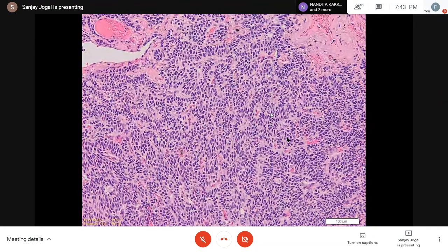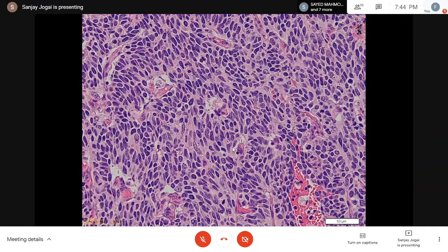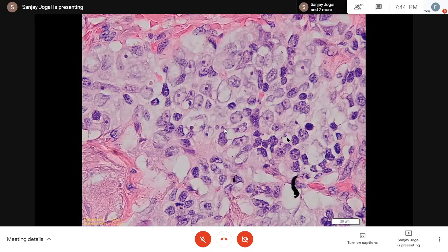However, where that section, where the tumor was merging with another nodule, the morphology is completely different. You can see cells which have more ovoid to slightly spindle nuclei. Let us look on a high power. You can see the chromatin pattern is completely different. They don't have that squamoid morphology at all. And in certain other areas, nucleoli start to appear, and the cells have a very vesicular pattern. And then there are still those hyperchromatic looking cells in the background.